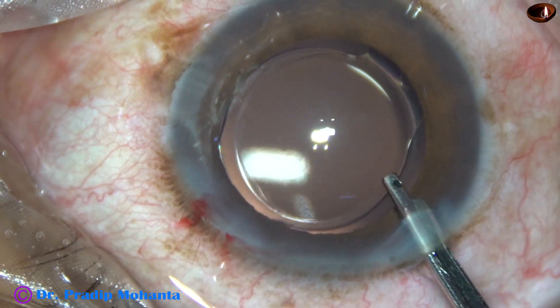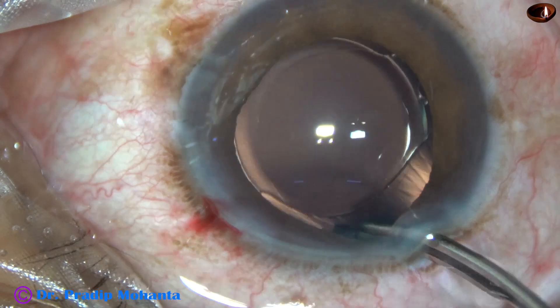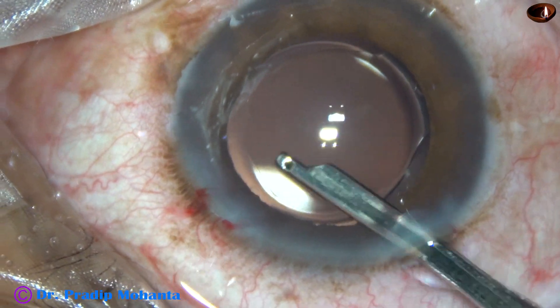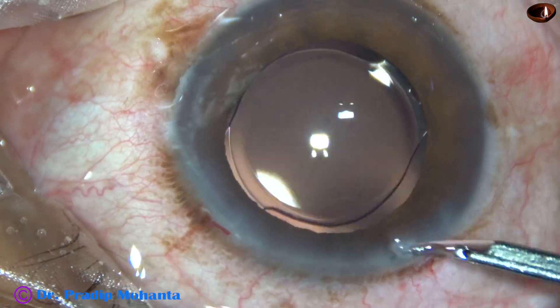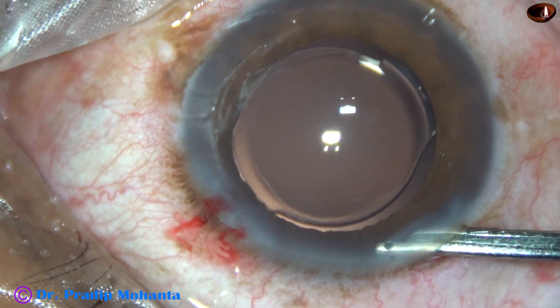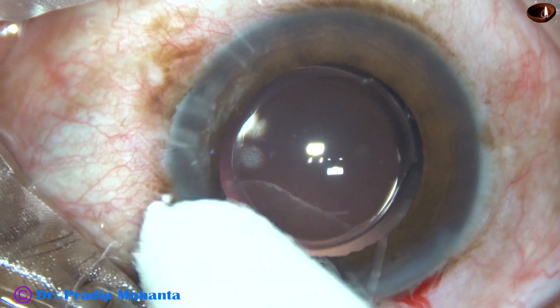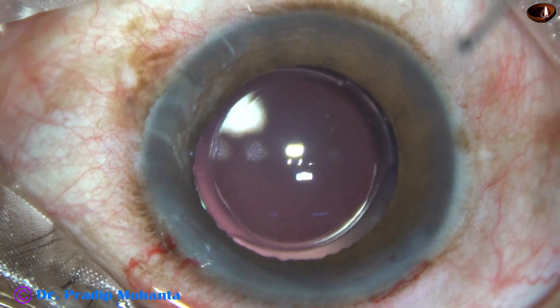At this time, any viscoelastic sticking to the corneal endothelium is removed, the capsular bag is irrigated once again, the lens is tapped, and the anterior chamber is nicely formed. The intraocular pressure is kept on the higher side, and the case is concluded after checking the wounds and applying a few drops of moxifloxacin.